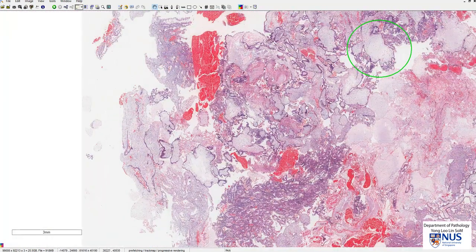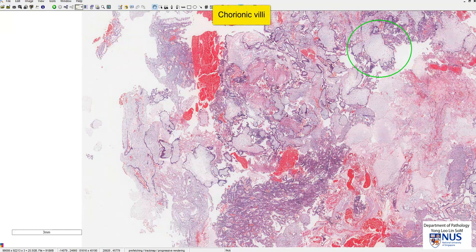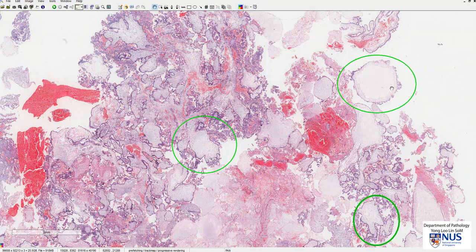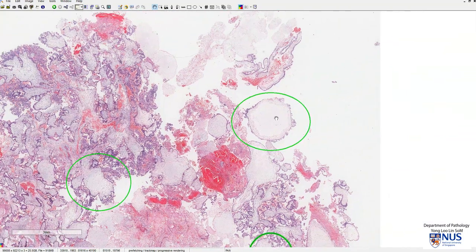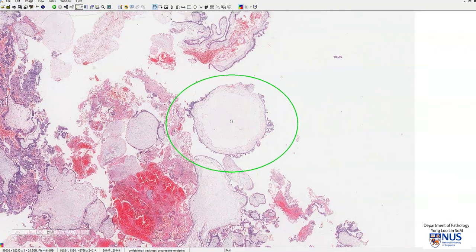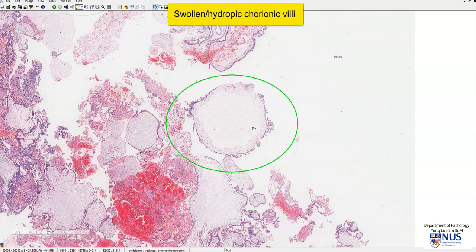All of these structures here are chorionic villi — part of the hydatidiform mole and part of the abnormal placental tissue. Looking at this particular chorionic villus, you will notice that it is very swollen and enlarged; we call this hydropic.